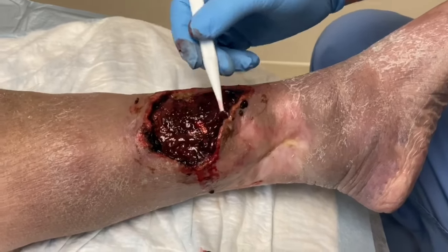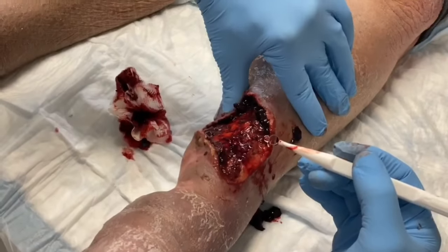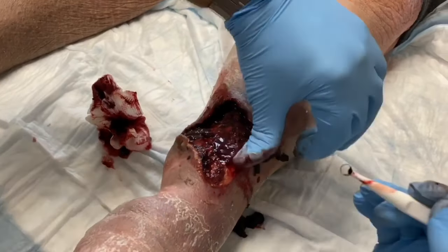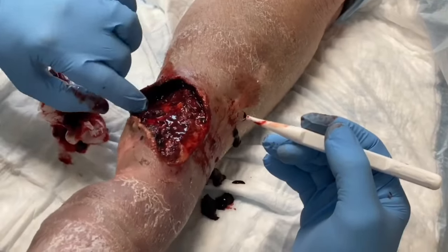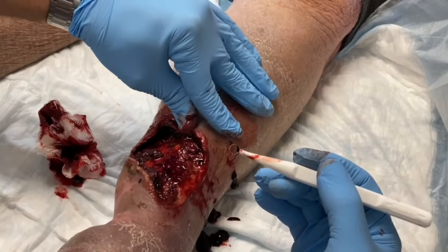You can see we're using a curette to remove any of this dry coagulated bleeding. A pocket has formed and we're using our fingers or instruments to get the bleeding and coagulated blood from this pocket.